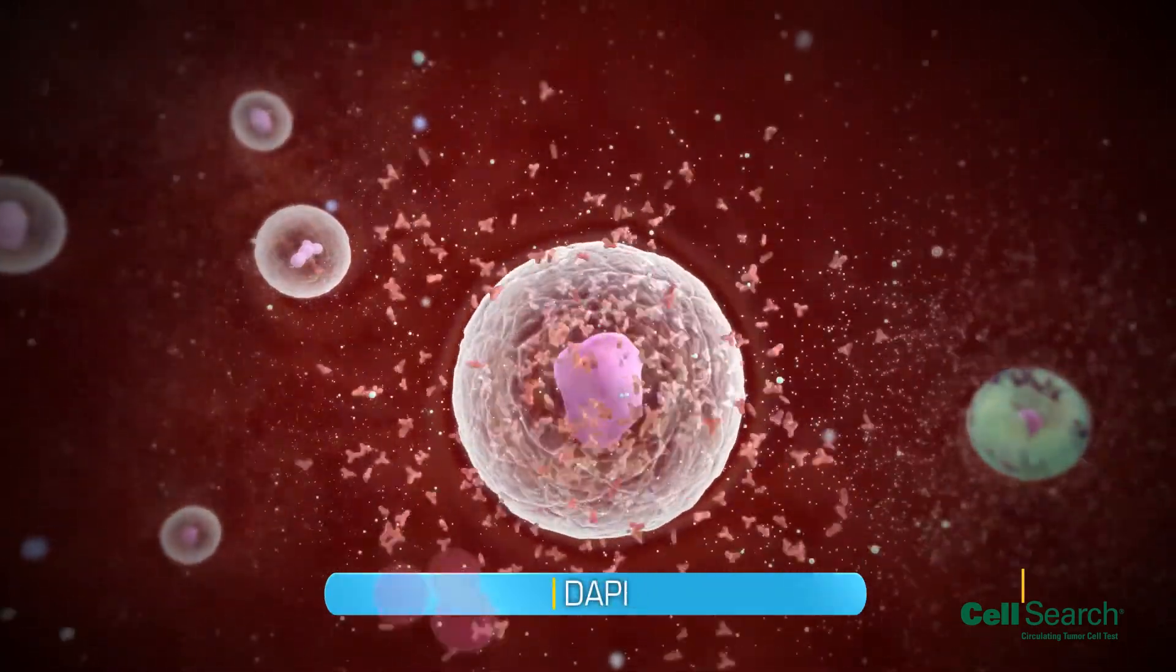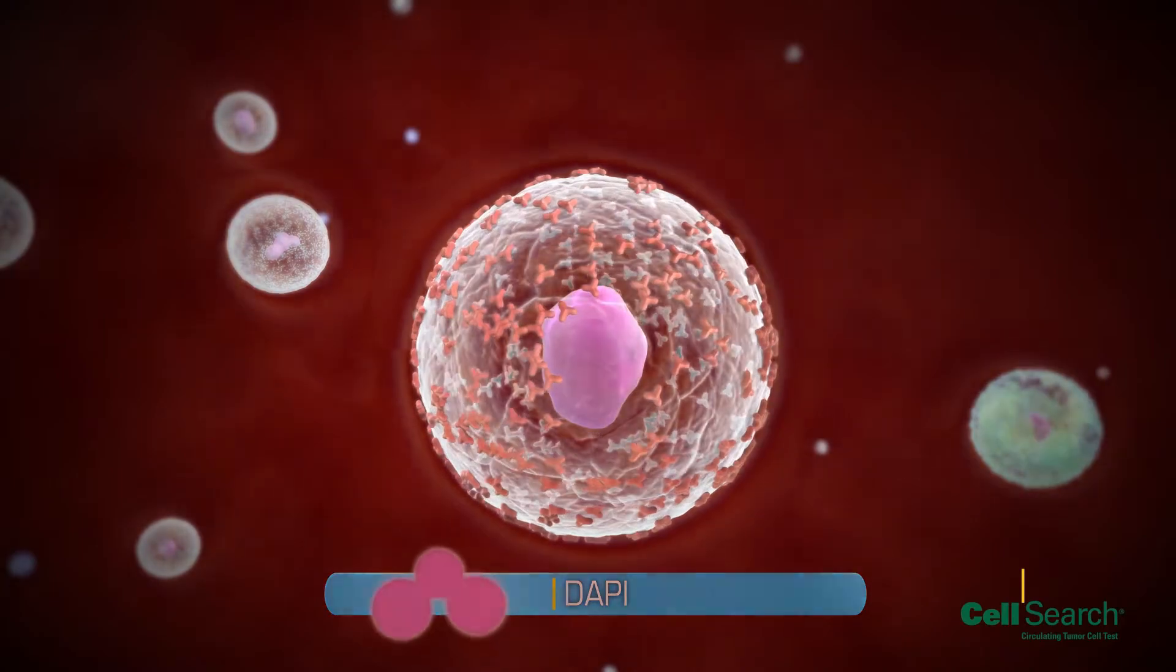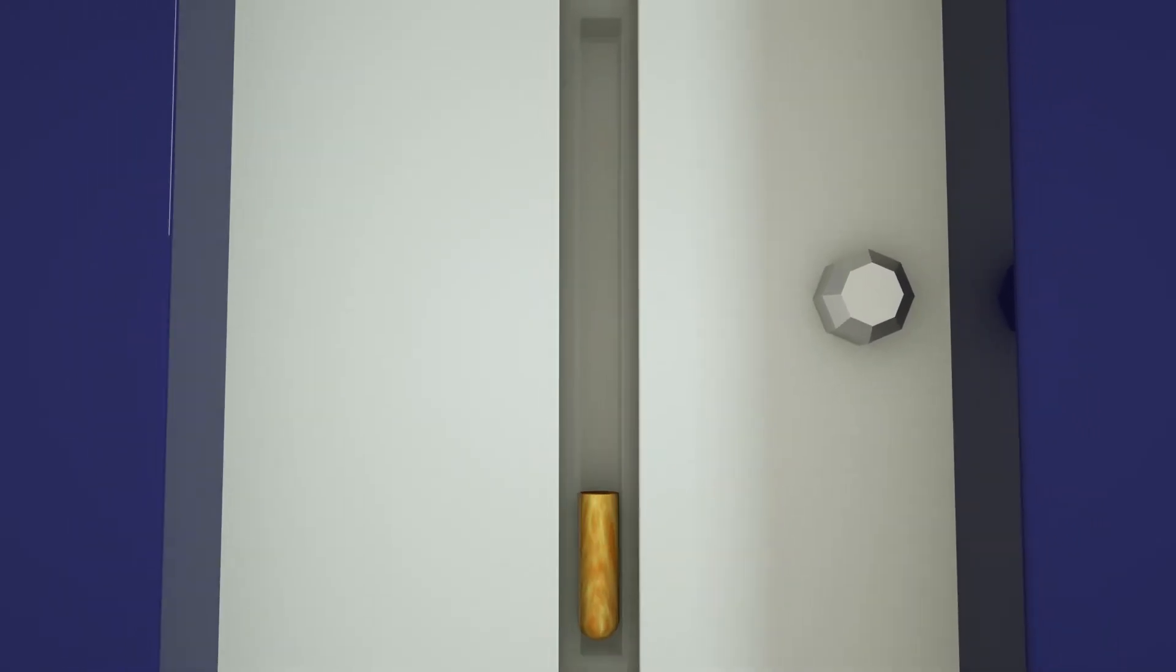These enriched and stained cells are then transferred to the CellTracks cartridge, which is contained within the CellTracks magnet for analysis.